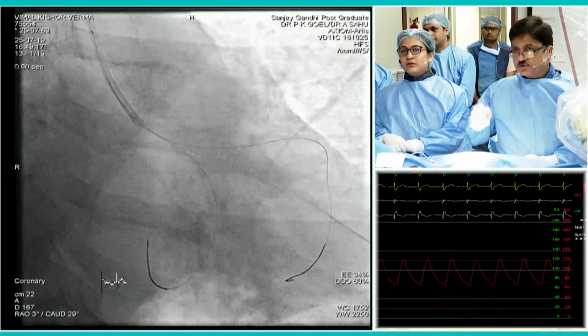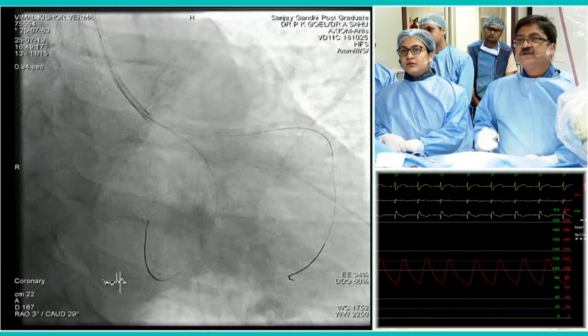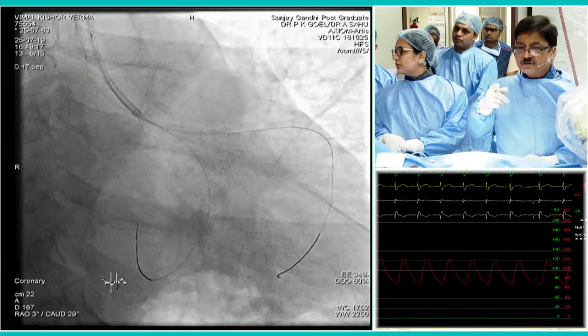Can you see the angio? Yes, yes. There, yeah. So not so fast, please.